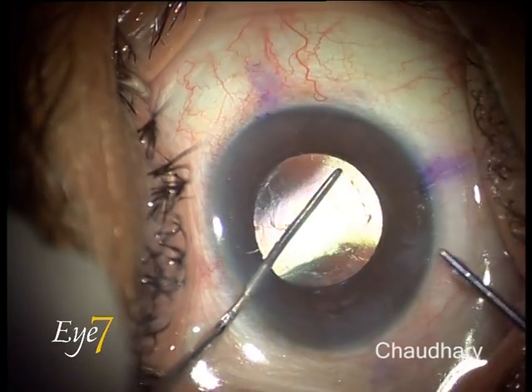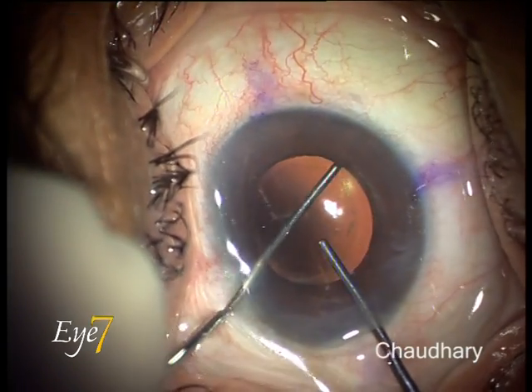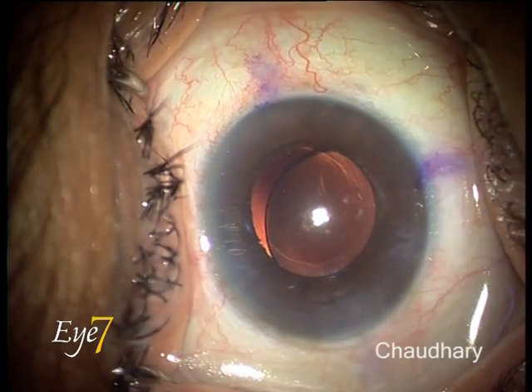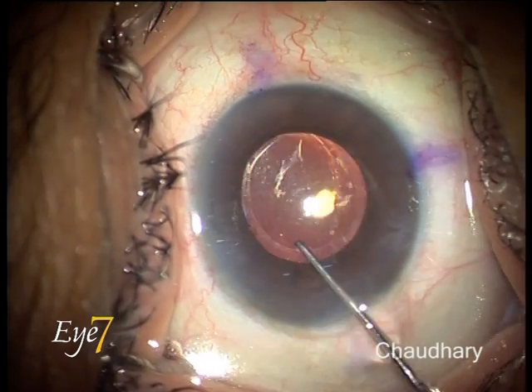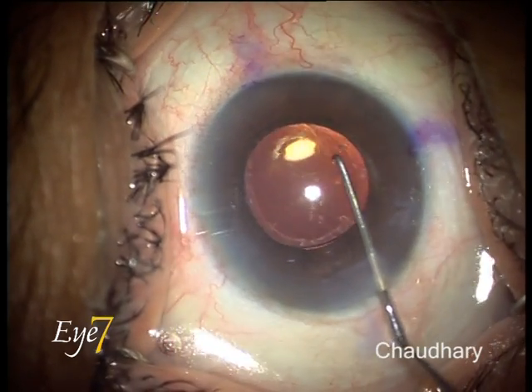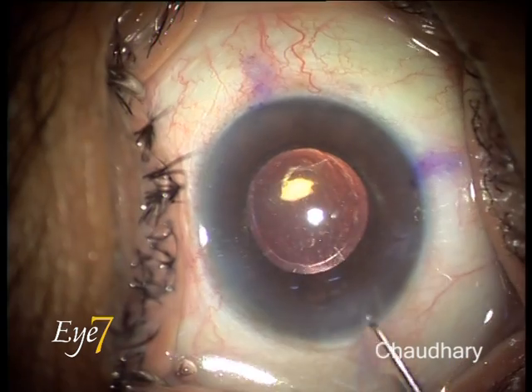One more attempt to dial this lens — as I move the dialer, yes, you can see those axis marks moving. The lens is dialing. I continue to dial and now I am trying to bring the lens to a position just 10 degrees short of the final position. This is the 10 degree short position.